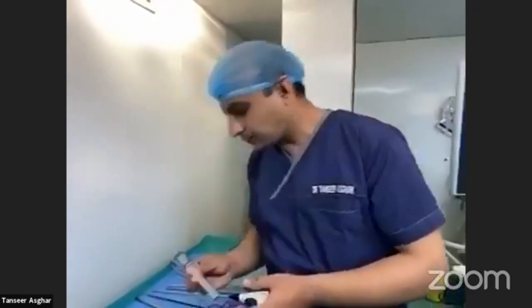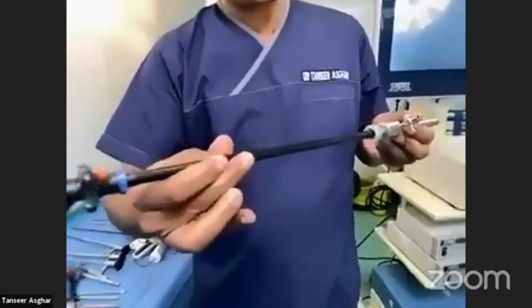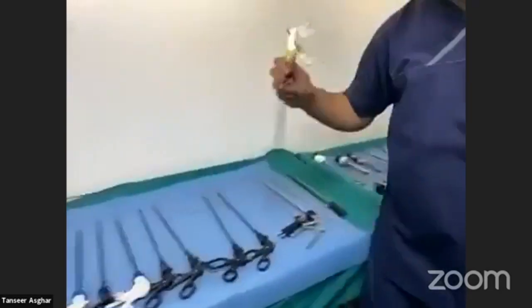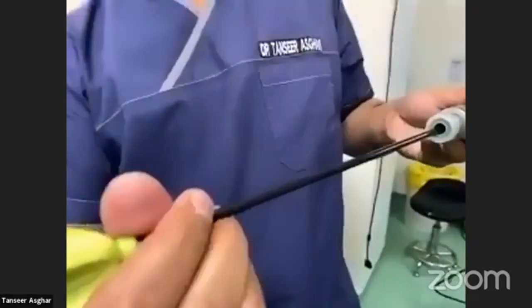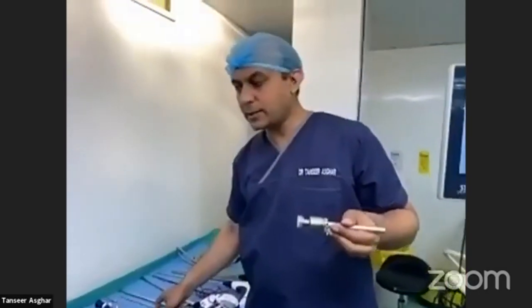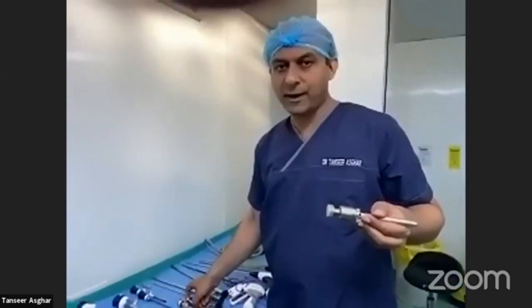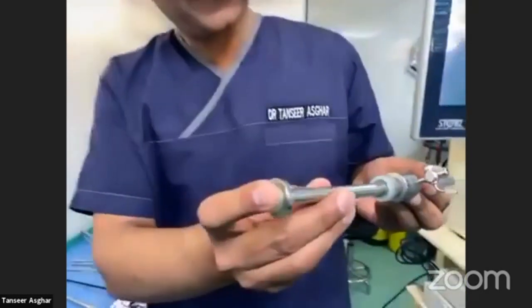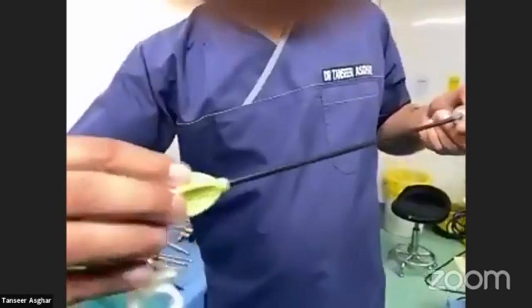If you are using a reusable 10 mm trocar, you can put a 10 mm instrument inside easily. But if you need to use a 5 mm instrument, it would leak. So you need a reducer or sleeve. You insert it into the port, place a finger over it to prevent leakage, and then you can very easily put a 5 mm instrument inside. This is important because the most common instruments in basic laparoscopy are 5 mm.